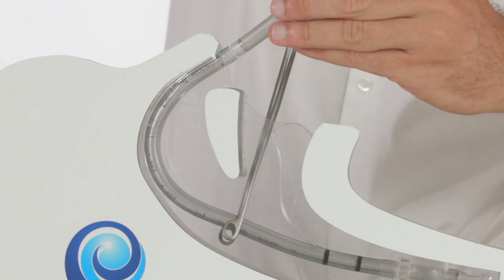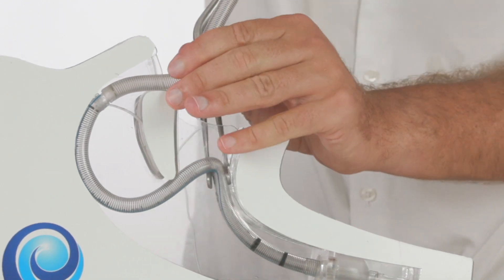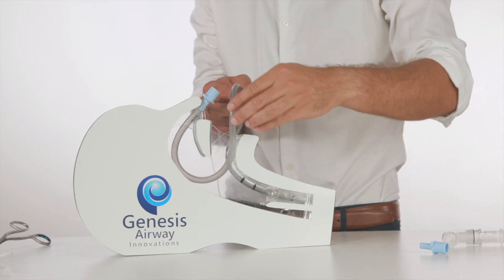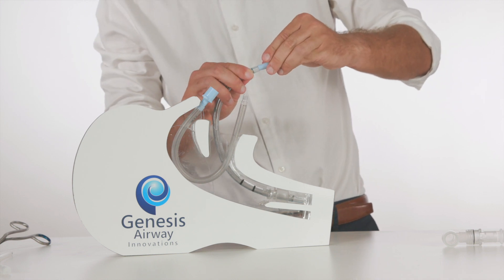The ETT tubing is grasped through the mouth with McGill's forceps, and with a pushing rather than a pulling motion, the tubing is retracted through the mouth. The two tubes are then disconnected by twisting, and the anaesthetic circuit is reconnected.